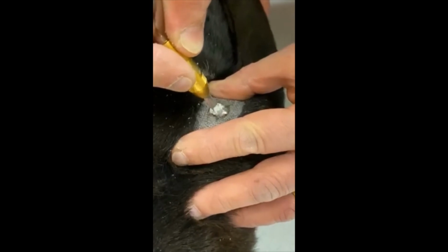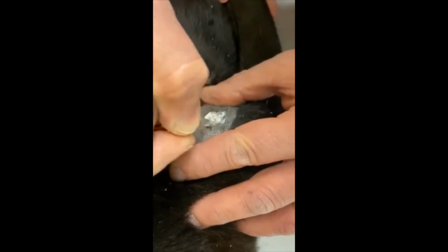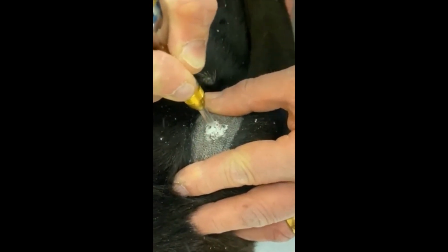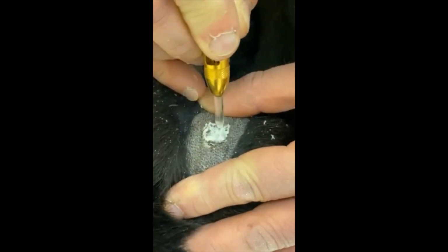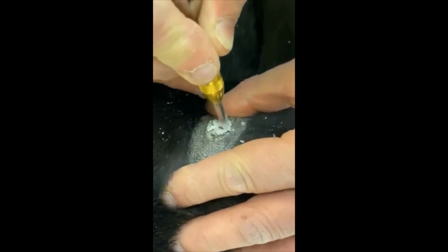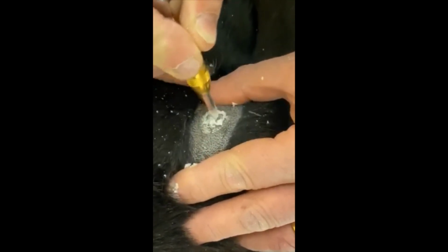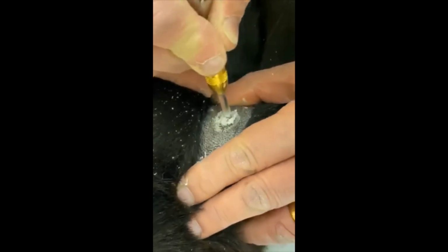As we go through, we are attempting to get to the root of the lesion and knock off any ice crystals that may interfere with the rapid freeze cycle, which is necessary for destruction of the mass. Because this is very broad-based and close to the skin, and I can feel the skin getting very cold, I'm going to shorten the cycle to about 30 seconds.